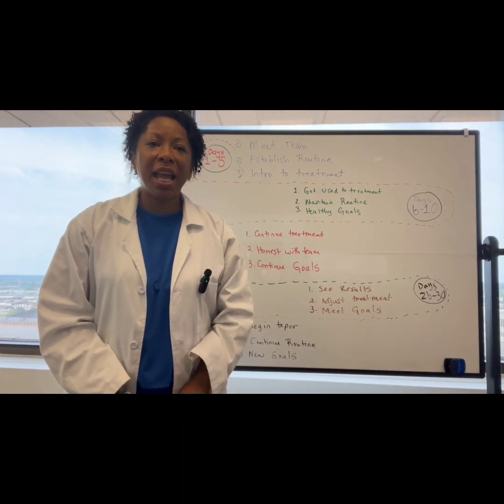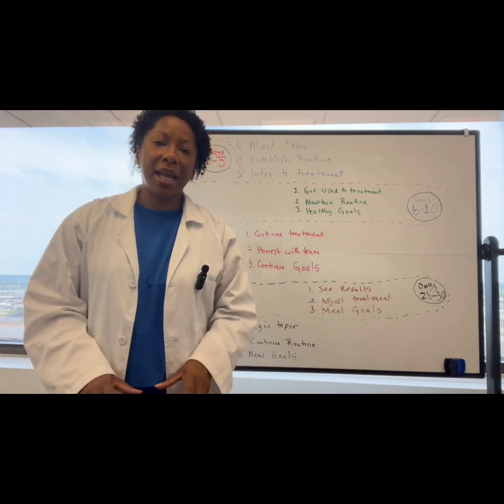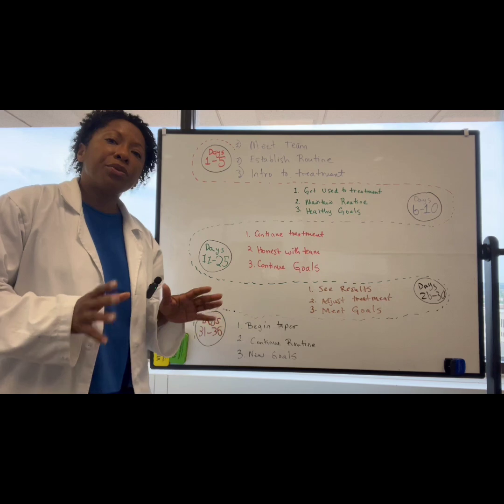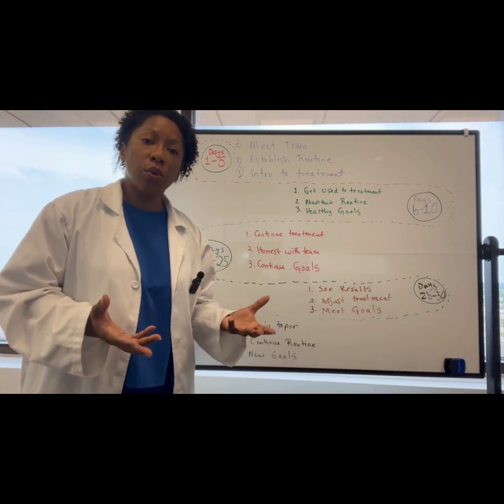Hello, I'm Dr. Bergina, and I'm going to walk you through a typical TMS journey. There have been some questions about that, and so I wanted to make sure that I could share this with you. The overall process for TMS, the recommendation based on the initial studies, is 36 total treatments.